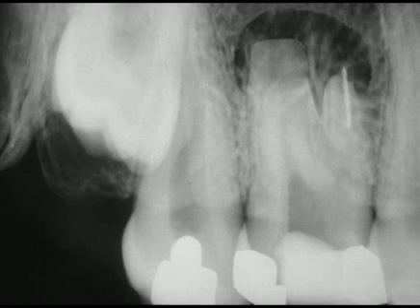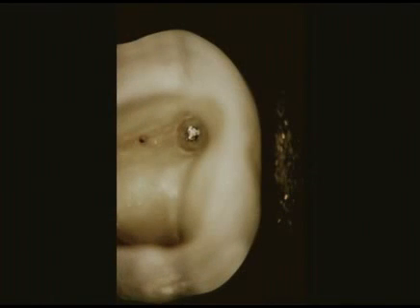Note the previous access, a broken instrument off-centered in the root, apisected roots, and a possible MB2 system. A clinical photograph demonstrates straight line access and complete visualization of the broken instrument. Notice the circumferential staging platform to facilitate ultrasonics. This was accomplished with an appropriately sized, modified GG. Notice also the previously untreated MB2 orifice.